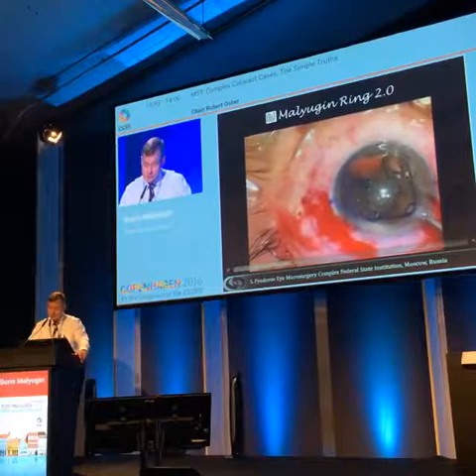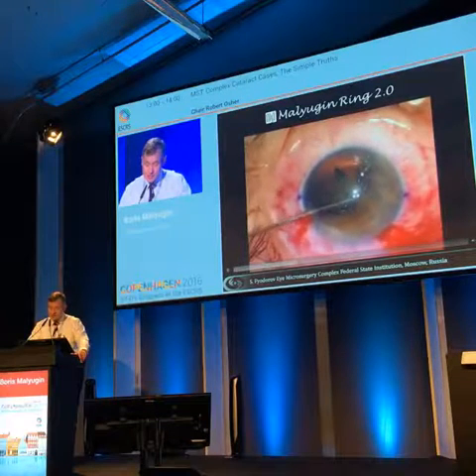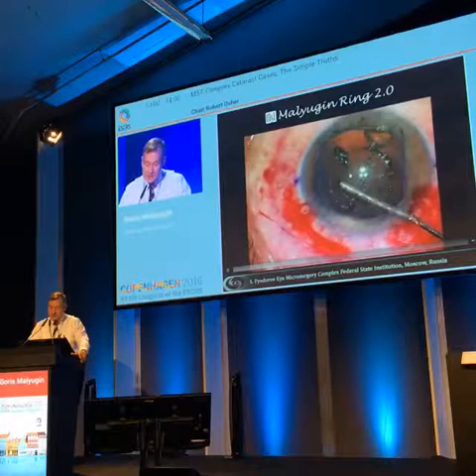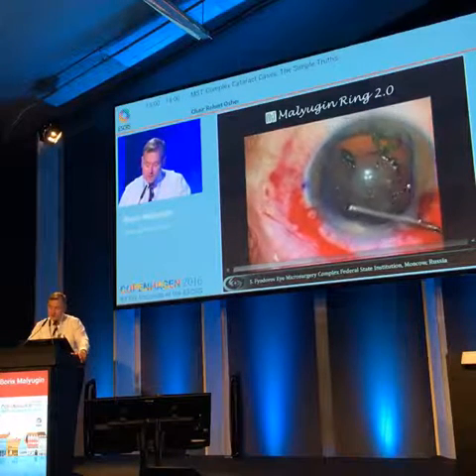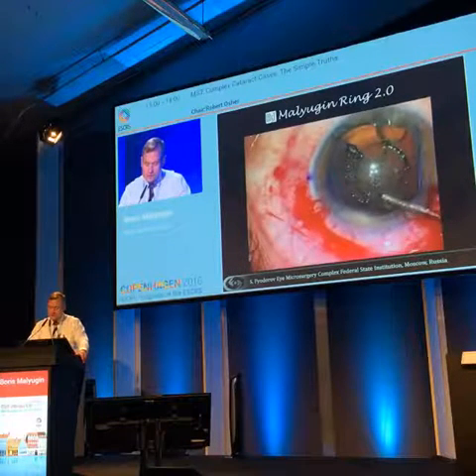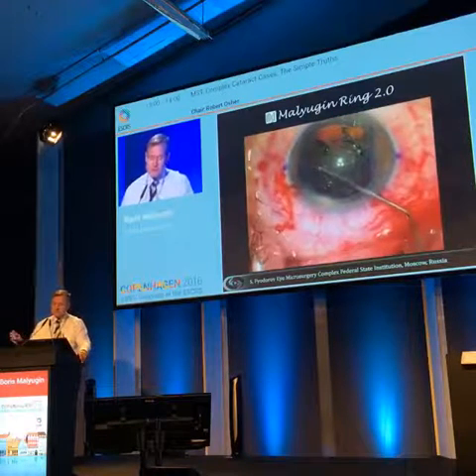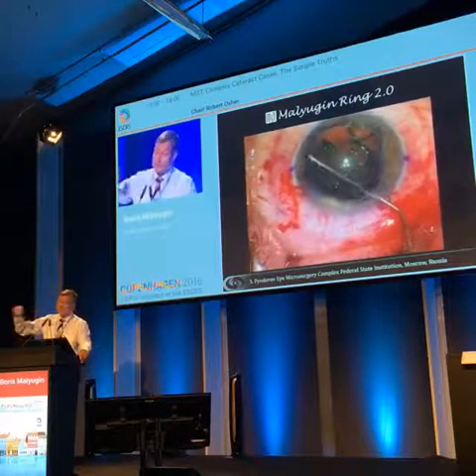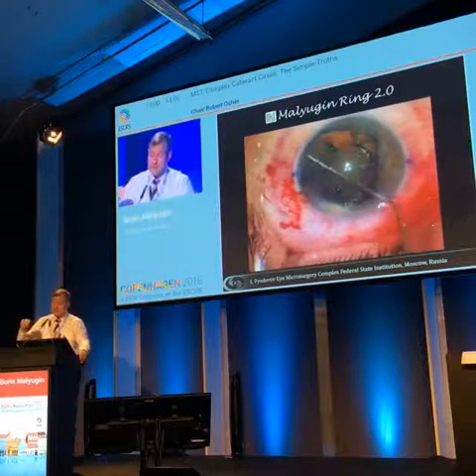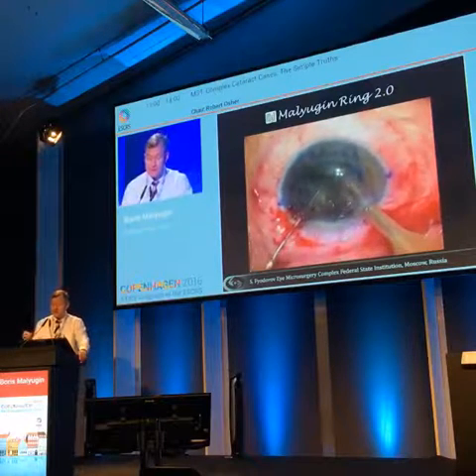As you can see here, there is a nice capsulotomy made by laser. We can see radial cuts on the lens. Then we have to check whether the capsulotomy was good, because when you're not certain, it's a good recommendation made by Zoltan Magid that you follow the contour of the capsule with your forceps, just to be sure that there are no tags and there are no residual adhesions in between the capsule and the capsulotomy flap.